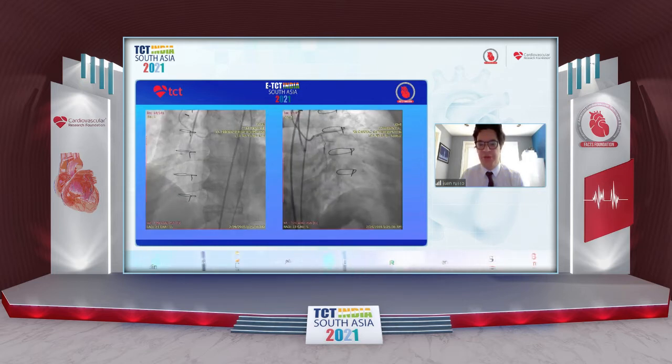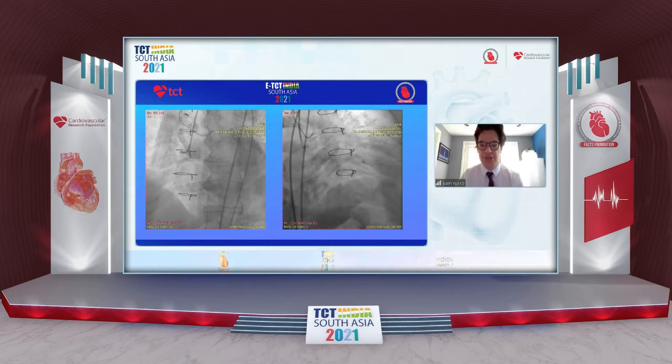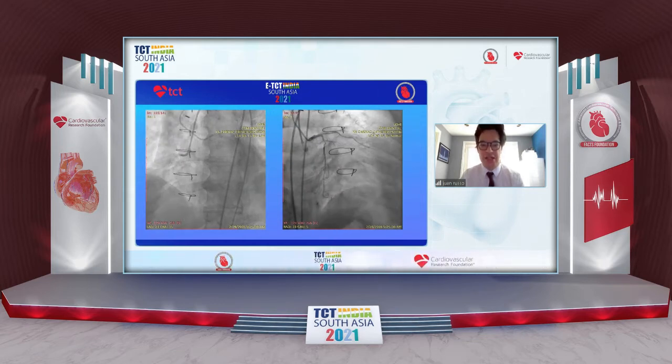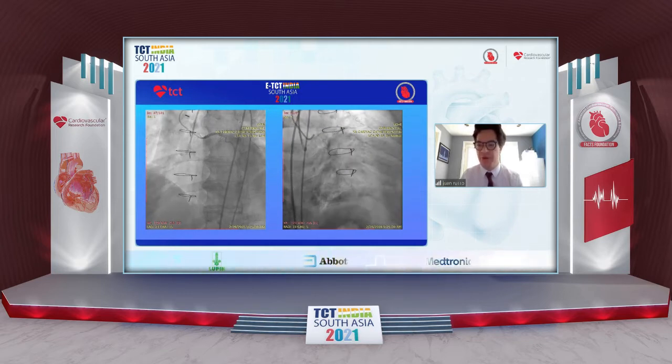The optimal point of reentry is very important because you need to ensure whether you're going to commit to stenting versus doing an investment procedure. In addition, there's new data suggesting that loss of important side branches, which were defined as branches more than 1.5 millimeters in diameter, can lead to increased MACE at 5 years.